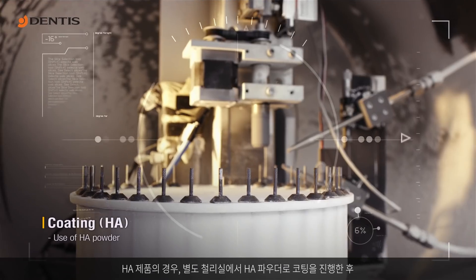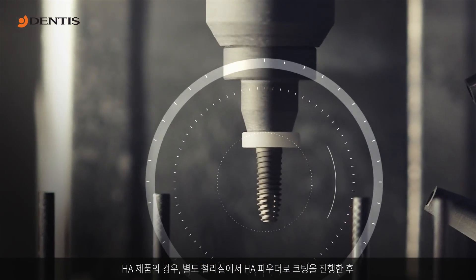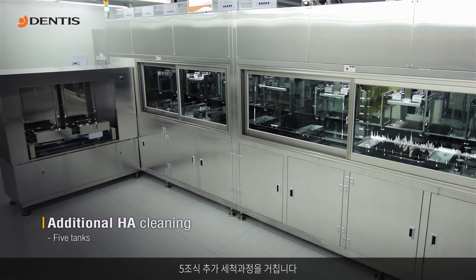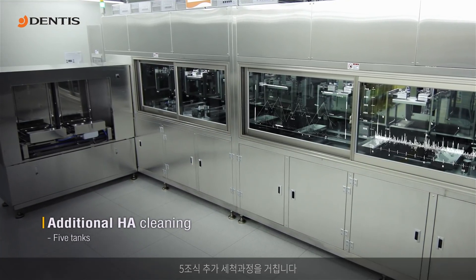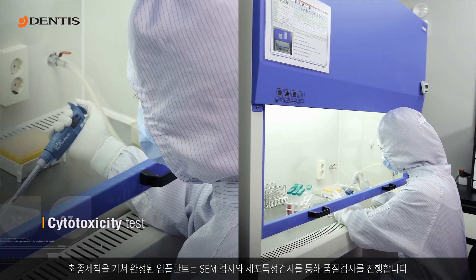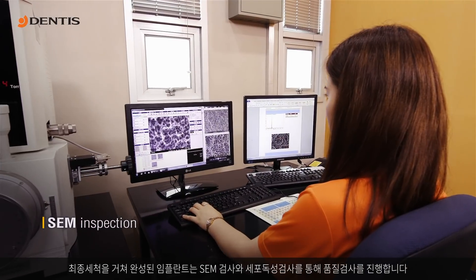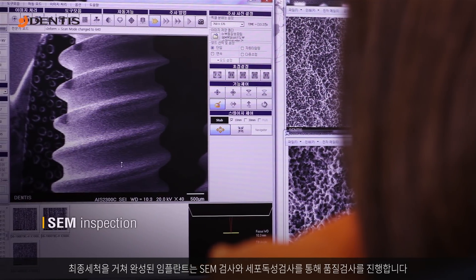HA products undergo a coating with HA powder in a separate treatment room and another cleaning in five tanks. After the final cleaning, the implants are sampled for a cytotoxicity test and quality inspection by SEM photos.